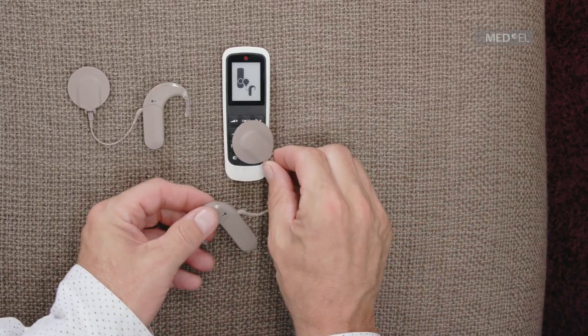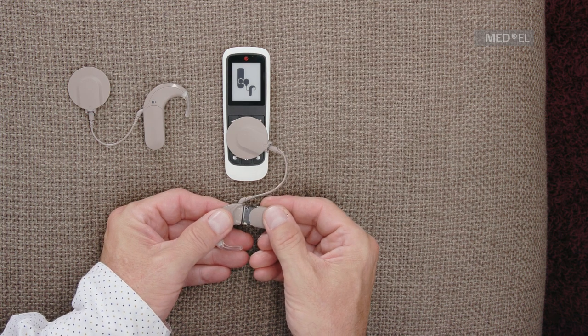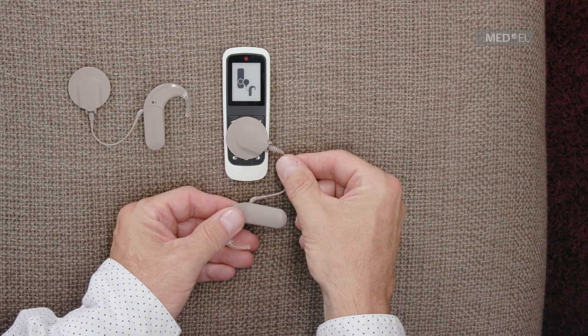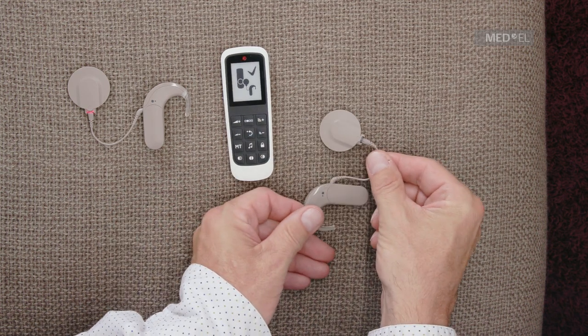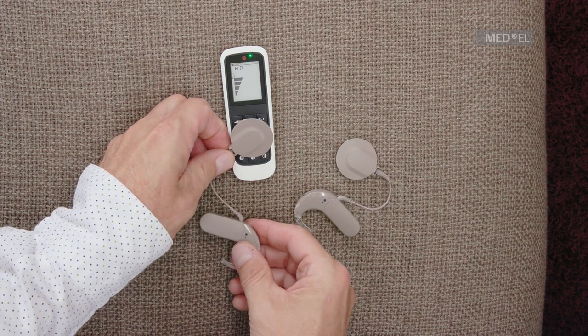Before using the FineTuner Echo, you have to pair it with your audio processor. Place the coil on the back or front of the FineTuner Echo. First, switch off your audio processor and switch it back on. It will pair automatically with the FineTuner Echo.